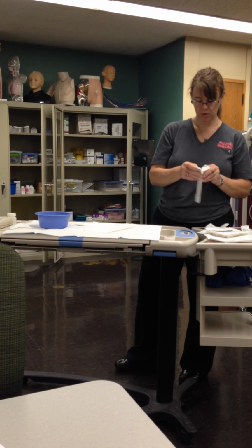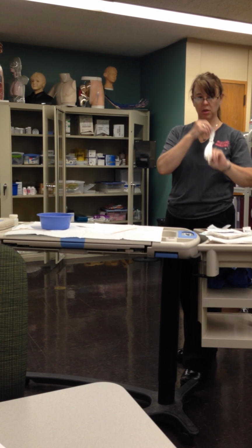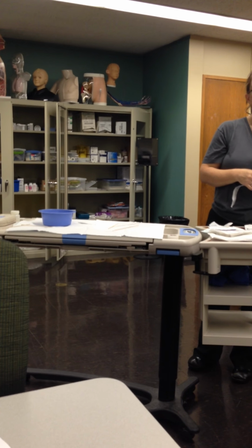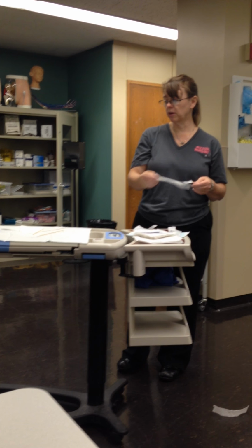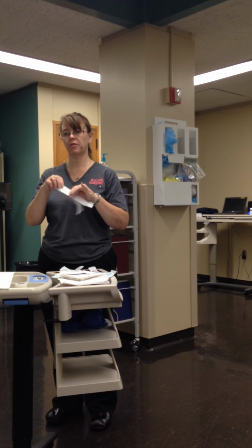So is there a reason why you're not holding? I understand the outside of the package is bad, but is there a reason why you're not? Oh, that's probably the... Yeah, that's easiest. Cool. Okay, never mind. You answered my question. There's all different ways. Okay. You just have to keep the principles in mind. You can't touch with your fingers because they're not sterile. The other thing is, remember that while the insides of these packages are sterile, the outsides are not sterile.